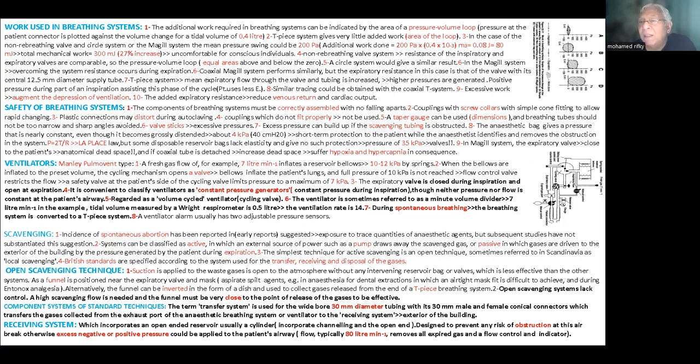This type of ventilator is volume cycled, because it cycles after a specific volume, and it doesn't have a really constant pressure during inspiration. It's variable.